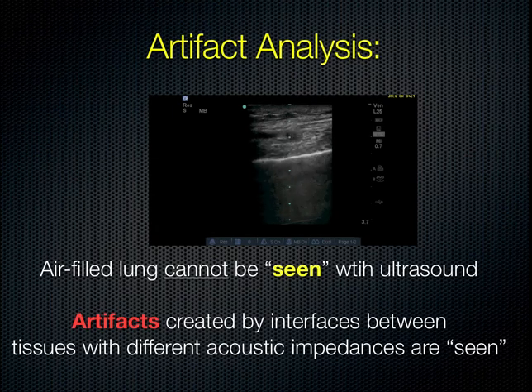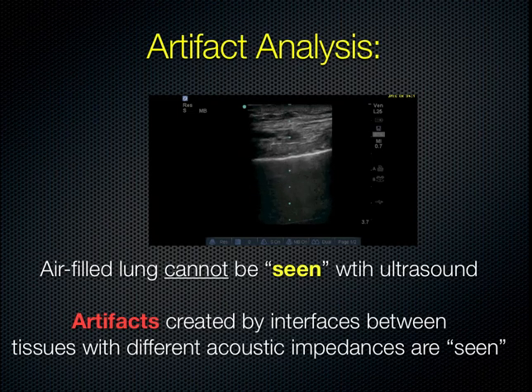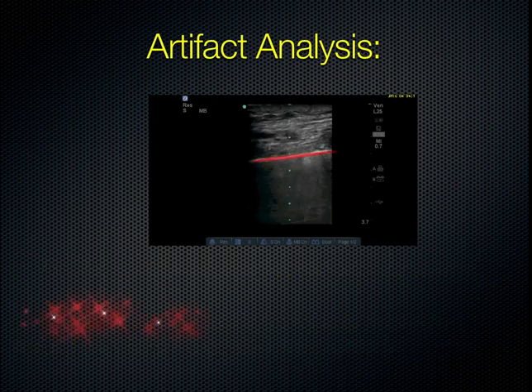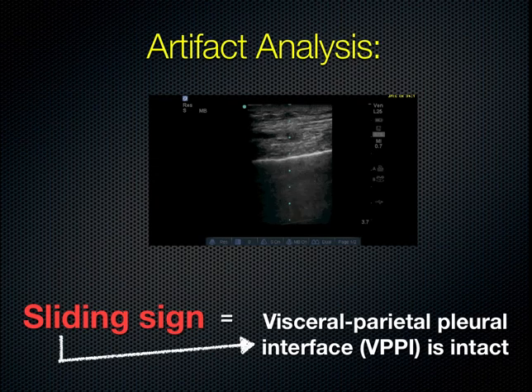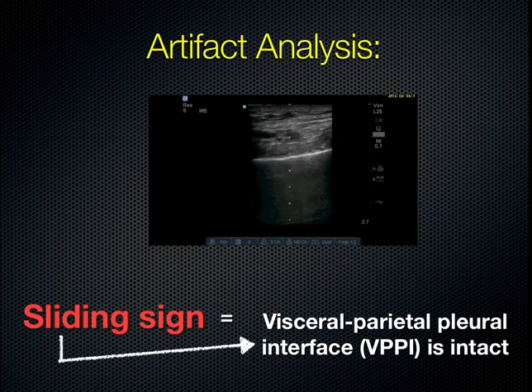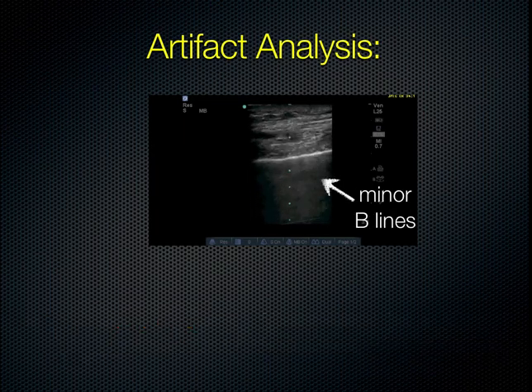Now we're going to use this high-frequency image to analyze artifact. We can't see the lung itself, but we can see the artifact created by the interfaces between tissues with very different impedances, such as the pleural line and lung. Here is the visceral-parietal pleural interface, and what we're seeing is the sliding sign — it tells us the visceral pleura is adjacent to the parietal pleura and they're sliding against each other. You can appreciate very small B lines that show the motion, which looks a bit like ants crawling across or shimmers. There are very minor B lines here and an A line, because this lung is mostly aerated.